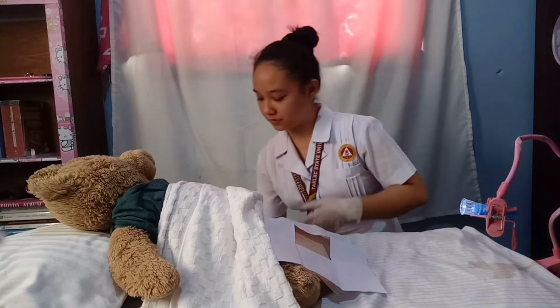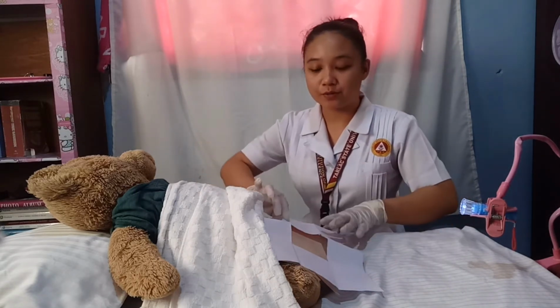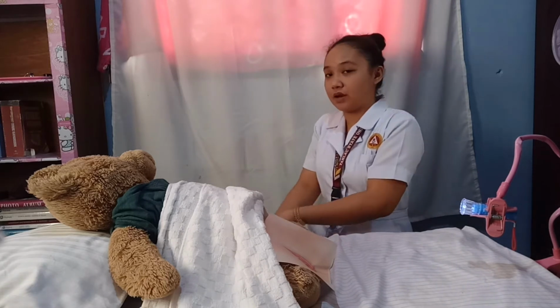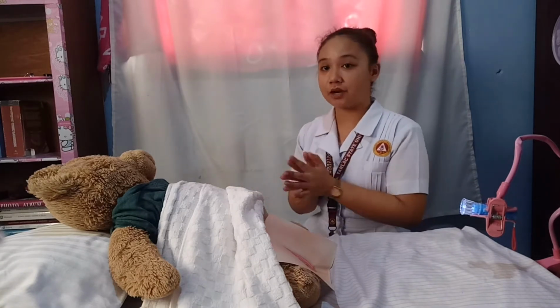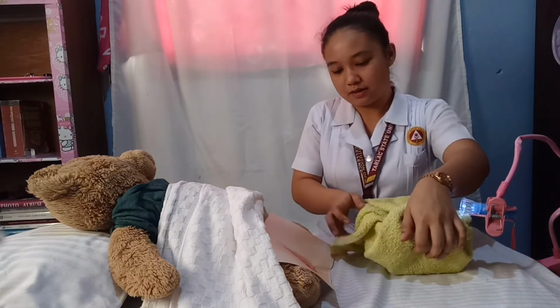Move this one. Also, you need to perform hand washing later on. Then remove your gloves. You need to perform hand washing, but I prefer here to use alcohol. You can also use a sanitizer. Now we need to open the sterile catheterization kit. Here on the bed, get this one and put it in here.